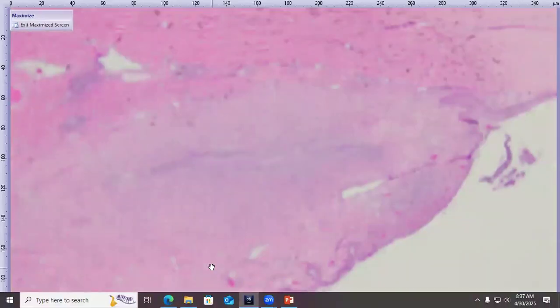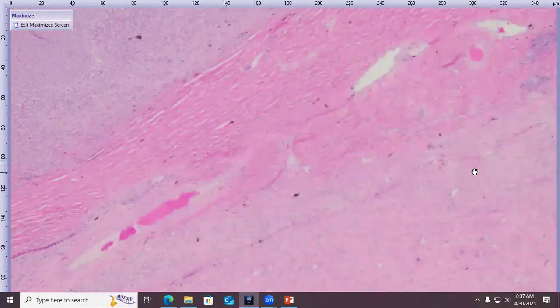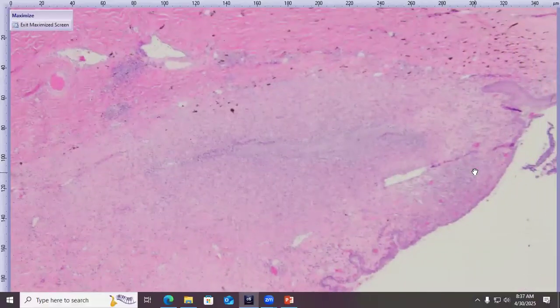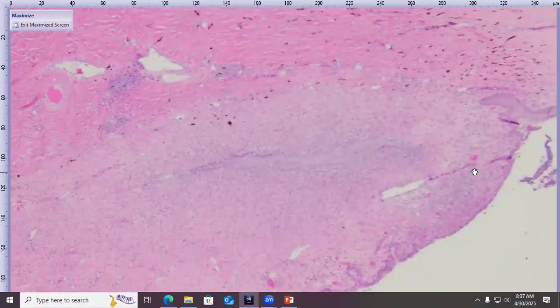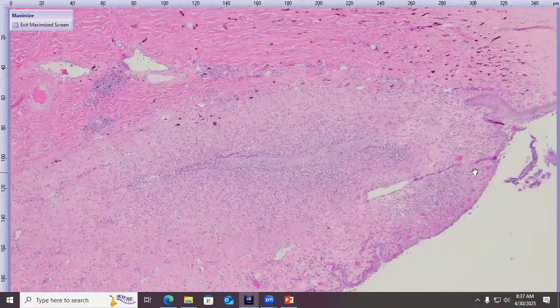And we only really caught this area of kind of linear defect here, and then didn't quite catch an area where maybe it communicated with the surface or an area where maybe it communicated with this abscess. Pointing towards the right location. But it's pointing towards the right location, exactly. So the circumstantial evidence at least is strong.